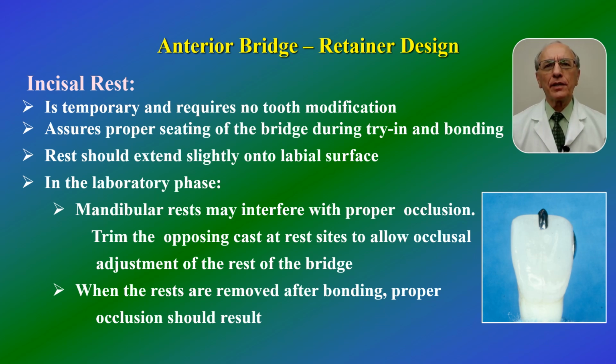Incisal rest is temporary and requires no tooth modification. It enables accurate seating of the bridge during try-in and bonding. The rest should extend slightly onto the labial surface to position the framework close to the tooth and also serve as a vertical stop during insertion.